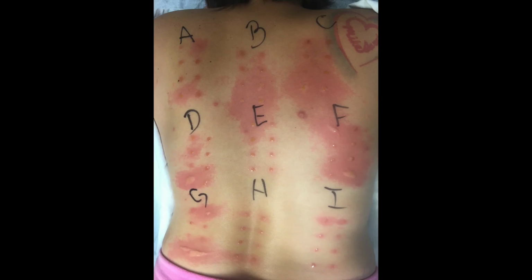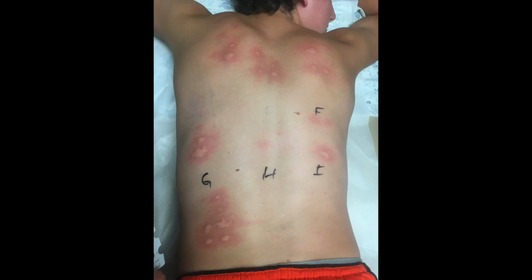In this picture, we can see where some of the positive reactions occurred in the D panel, especially in D5, F2, 3, and especially F4, and also some in the G panel. In this picture, the alcohol wash had already been started before the picture was taken. However, you can clearly see the positive reactions in the raised white areas. There were a few in the A panel, B, C, D, 1 and F, and then a few in the G panel as well. These are what we're looking for, positive responses.